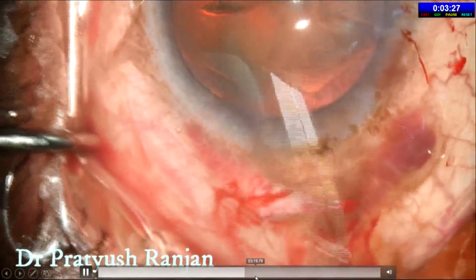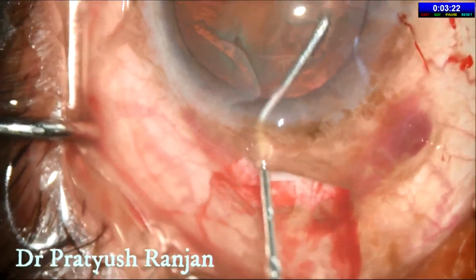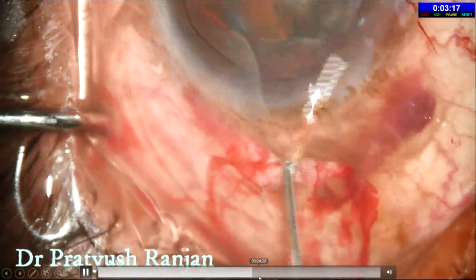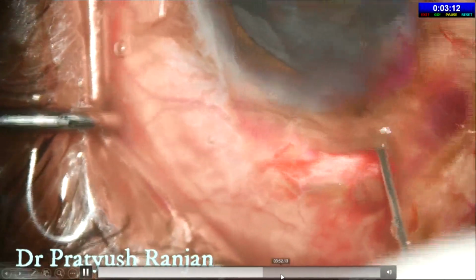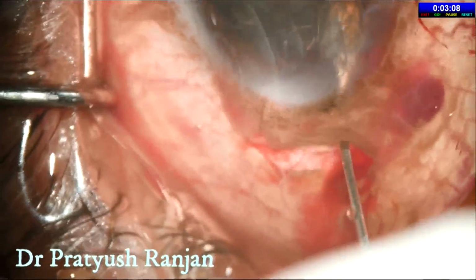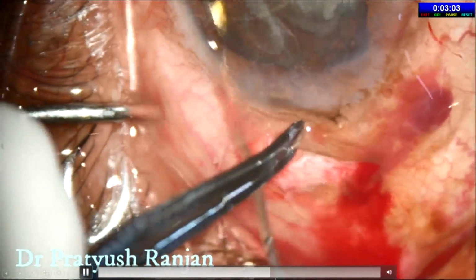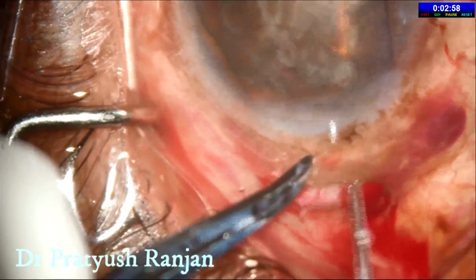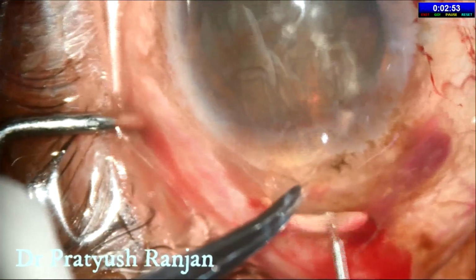Hydro like you do in Phaco. The only difference is we try to pop it, because once it gets popped, half of your troubles are gone. And then, as Professor Ruchi Goyal has explained various methods of nucleus delivery, you can use any one which you like. You must try everything before settling on one, because again, as I told you, you will require a different set of skill for every patient. And you must deliver best for each patient. And that you can only do when you know everything.